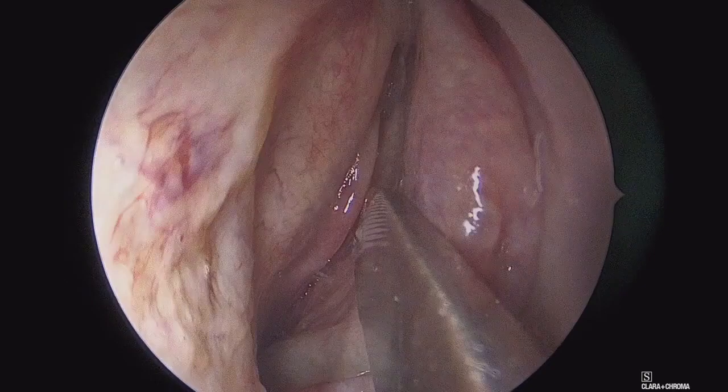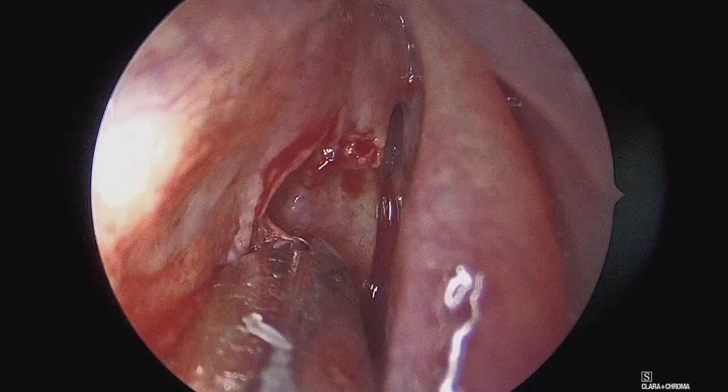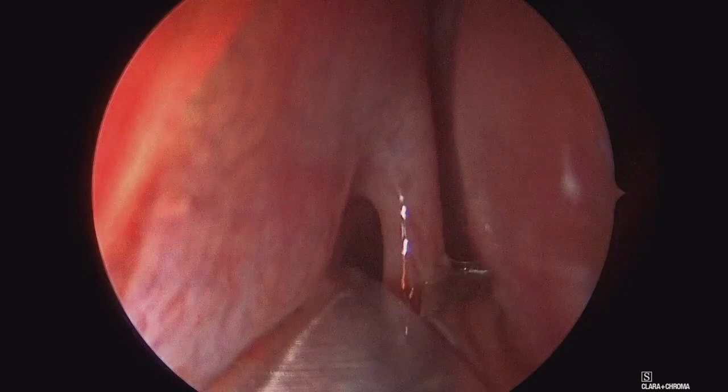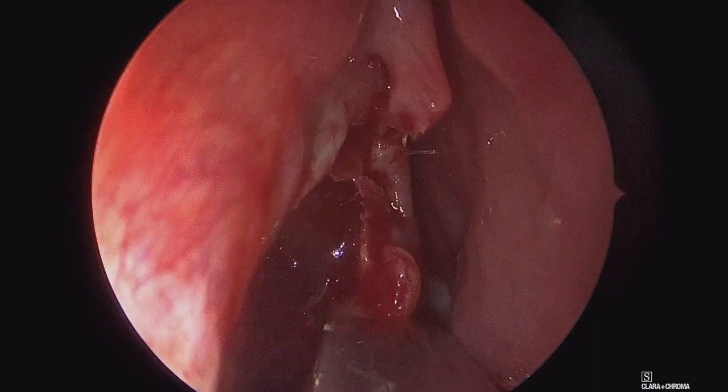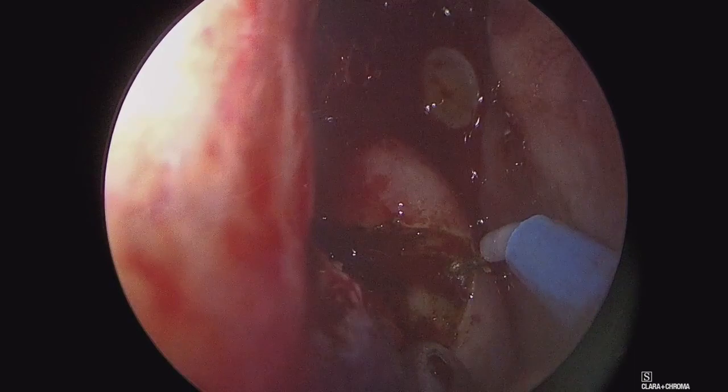Now we are on the right side. At this point, we had a high degree of suspicion for this being a JNA but did not have pathologic diagnosis yet. Here we are opening up the right maxillary sinus just in the axilla of the middle turbinate to facilitate access, as we'll need to get laterally into the pterygopalatine fossa as well. Prior to accessing the tumor and getting significant bleeding, we'll do some of this sinus work up front, then use a needle tip bovie cautery to remove a portion of the anterior tumor and send it off for frozen section pathology to confirm diagnosis.